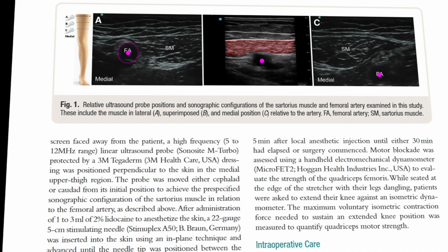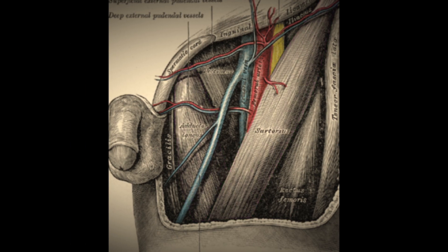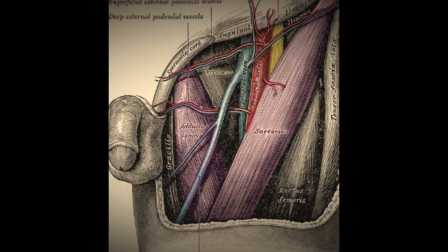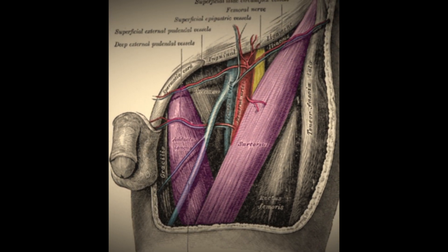But that doesn't make any sense to me, because if you go to the effort of putting a probe on and looking at anatomy, you might as well do it properly and find where the apex of the femoral triangle is. Remember that the apex of the femoral triangle is defined by the junction between the sartorius and adductor longus. If you move your probe a little further away from you, you can see that.